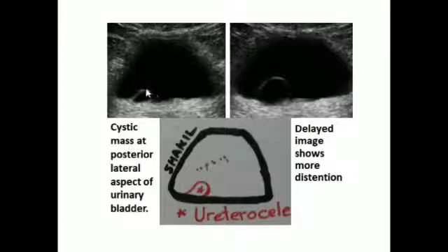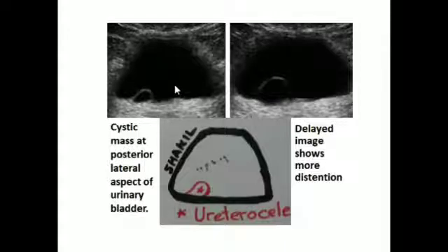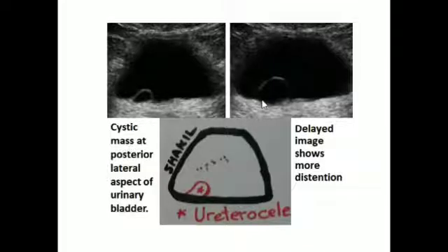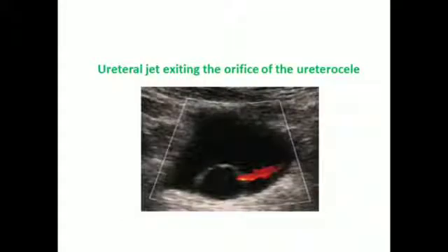In this image, we see a cystic mass at the posterolateral aspect of the urinary bladder lumen. In this next image, the size of the ureterocele is enlarged, demonstrating that in real time it can change size due to filling and emptying. This diagram shows the ureterocele and the urinary bladder, with the orifice of the ureterocele visible.